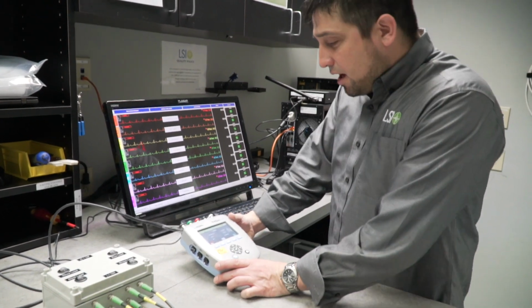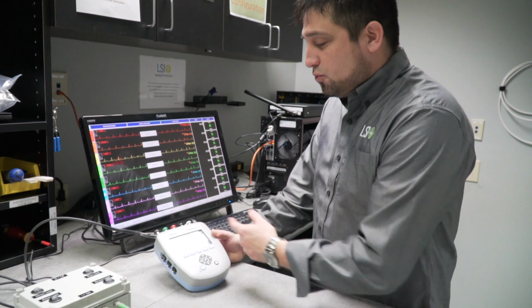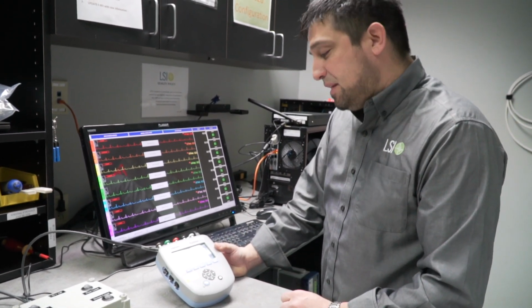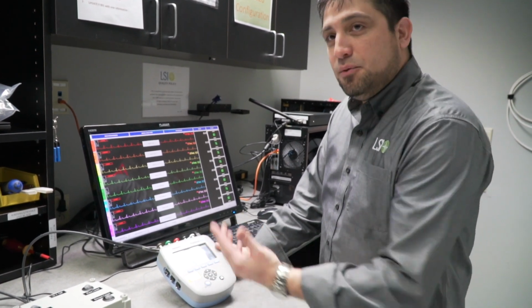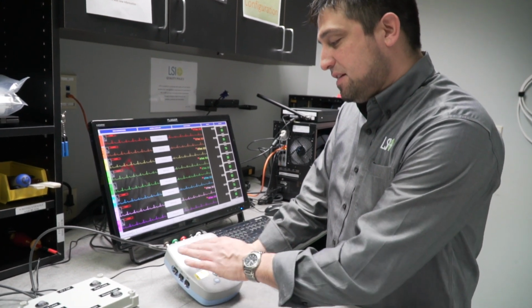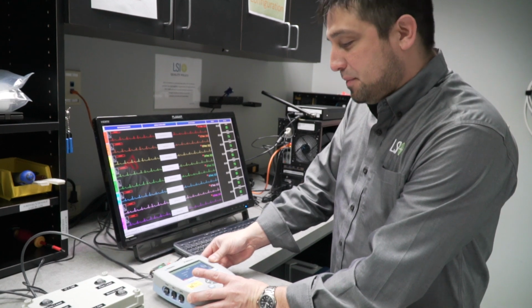So first things first, we have our patient simulator. The amplitude, which is pretty typical, is 1 millivolt. The heart rate that we're going to be using is 80 beats per minute, which is just a standard heart rate. And the ST would be if there was some sort of problem. We're not going to introduce any problem. We're just going to say this is a normal sinus rhythm at 1 millivolt at 80 beats per minute.